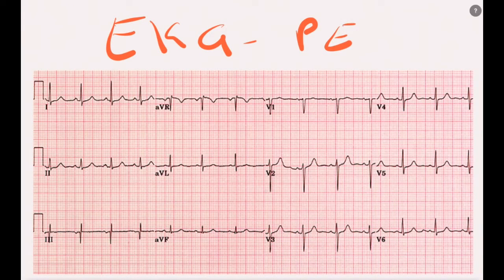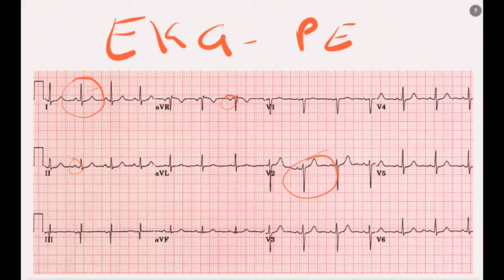This is a normal EKG that we're looking at right now. What's normal about it? Well, the voltages aren't too big, everything looks about the right size. It's sinus rhythm because you've got a positive P wave in two and the P wave is negative in AVR, so that's coming from the right spot. It's got a normal left axis because you're mostly upright in lead one and mostly negative in lead three. Everything else looks good — all the ST segments look flat.